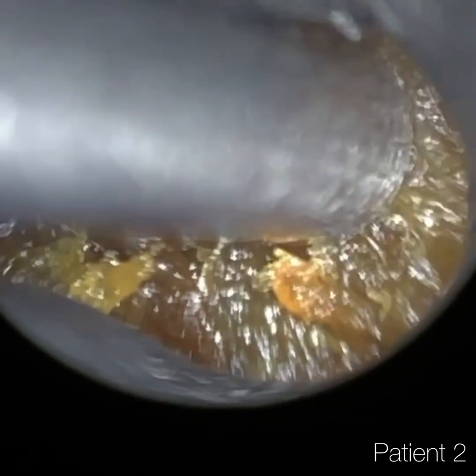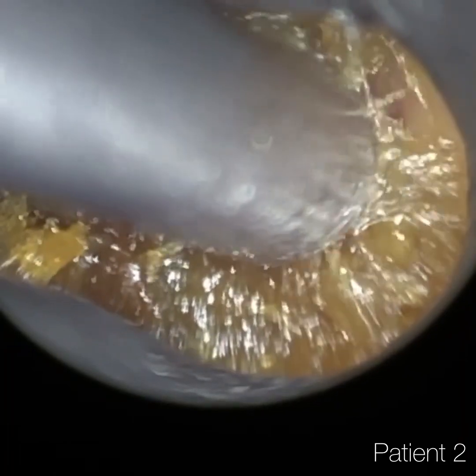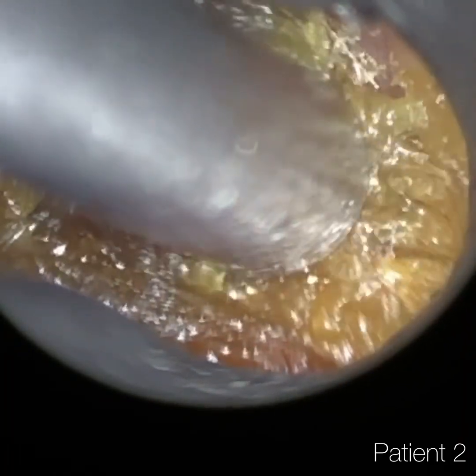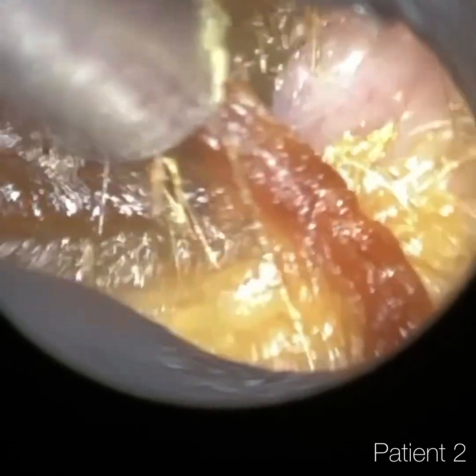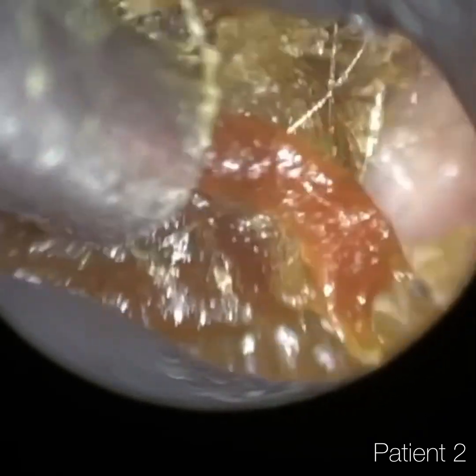You can adjust the focus and the brightness, and it's really straightforward to do. There is a zoom function — we're going to try and simplify the zoom function — but you can see that it's a great magnification here.